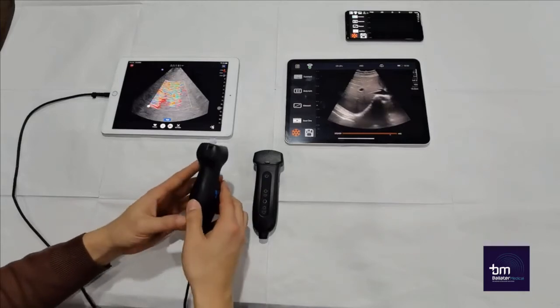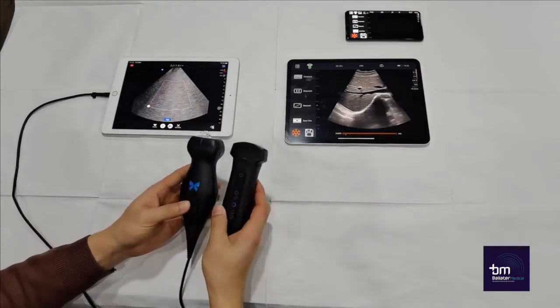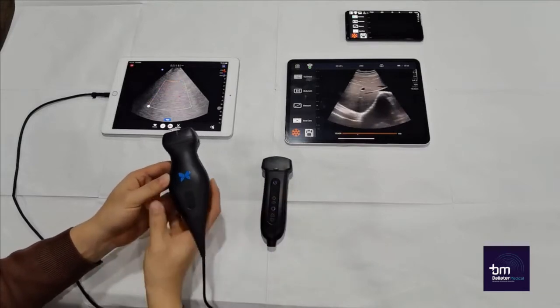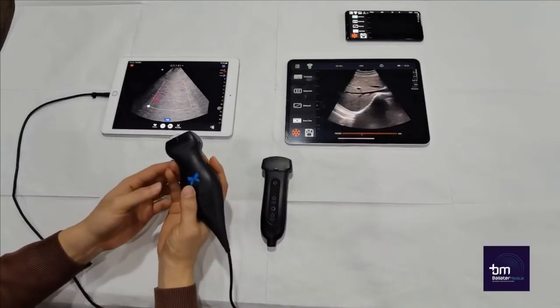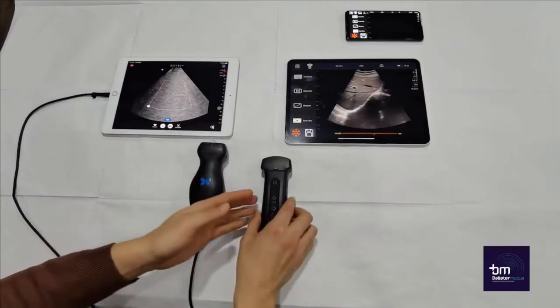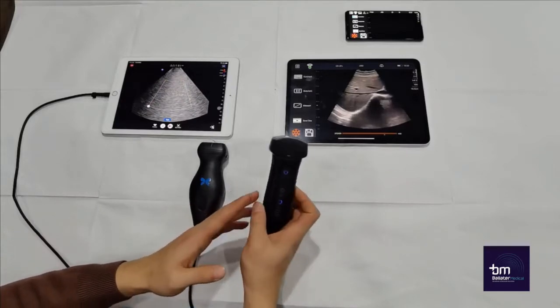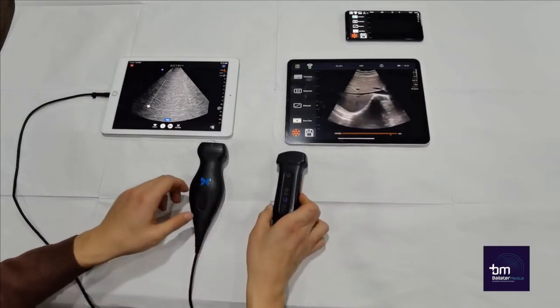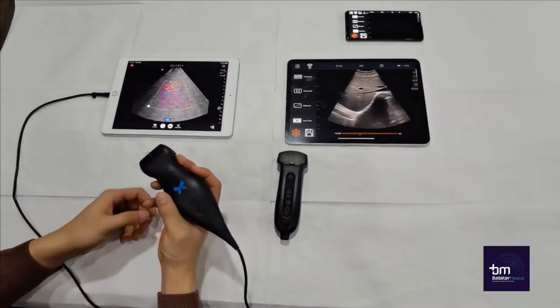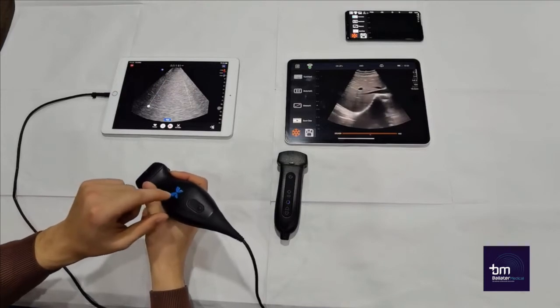Firstly, you can see that the Butterfly IQ is bigger than the Yuki Q7. The Butterfly IQ is also heavier, with it being 310 grams, whereas the Yuki Q7 is around 160 grams. So the Butterfly IQ is much heavier than the Yuki Q7. The shape and size of the Butterfly IQ is also a bit awkward to handle, with the device being heavier towards the back.